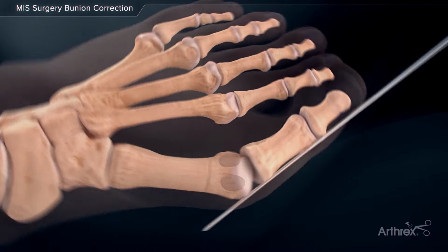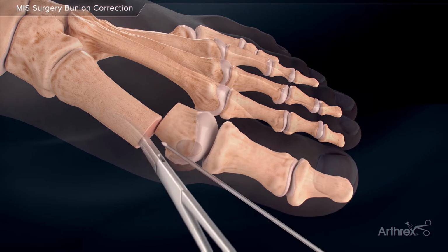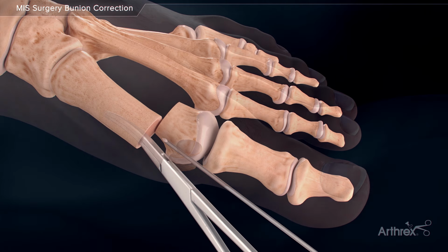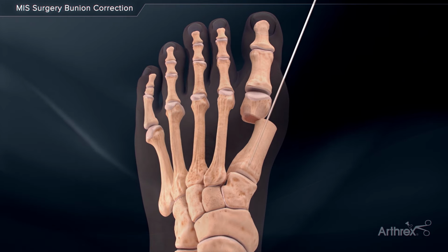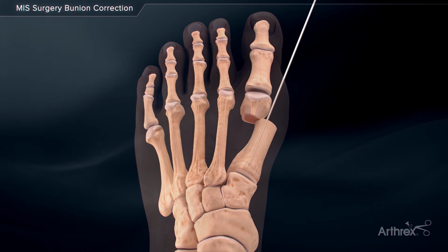A curved hemostat is placed through the incision and into the proximal metatarsal shaft to assist in lateral translation of the capital fragment. When the surgeon is satisfied with the translation and rotation of the sesamoid complex, while holding simultaneous abduction of the hallux, the guide wire is advanced midline through the medullary canal until it is abutting the proximal aspect of the metatarsal near the TMT joint.